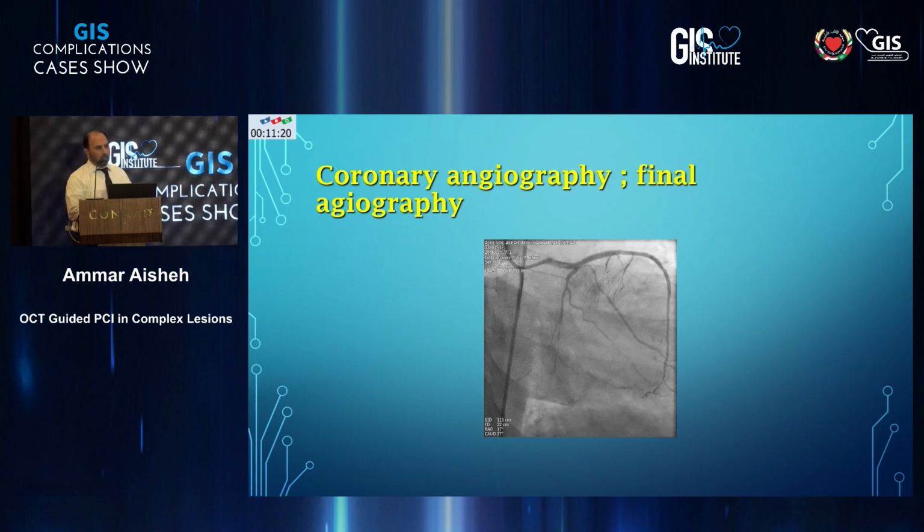and that again over the years has been shown to give a very good result, and outcome. Proximal stent if you need to, and then distally drug-eluting balloon. That's also another option.